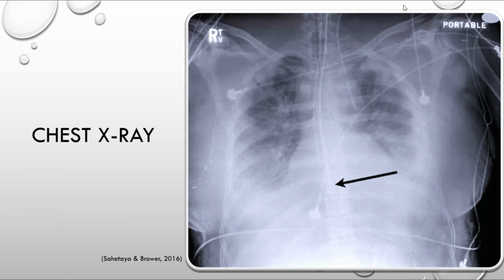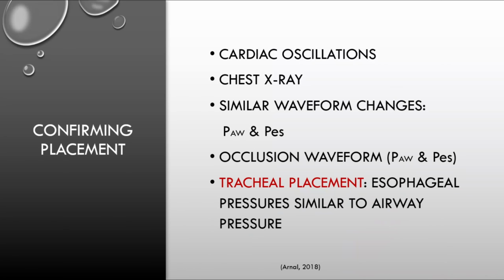This is proper placement with the chest x-ray. As you can see, it's sitting right behind the heart, right about where the xiphoid process is. The balloons we use here at Cottage are kind of hard to pick up, but just be on the lookout, because you want to get a chest X-ray if you can after you place the balloon.